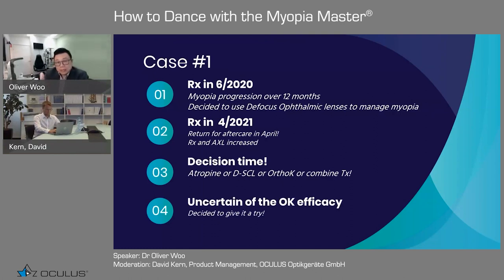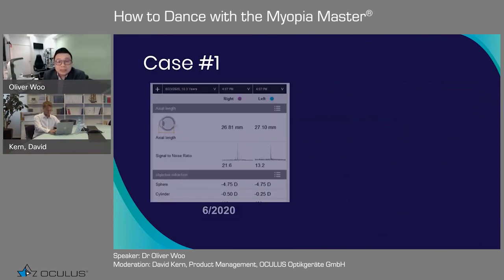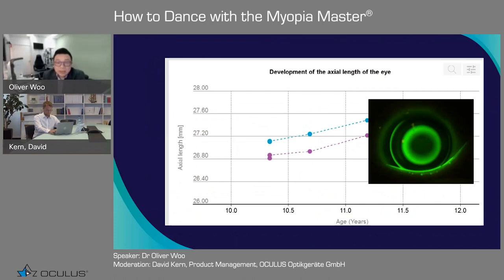So this is the number we can see: the prescription changed about 0.75 over about 8 to 9 months, and axial length changed roughly 0.4 millimeters for both eyes. The parent can understand all these numbers now, because when we show them what it looks like and what it means, they understood it. And the K reading is around 41 in both eyes. So that's the axial length change before we used orthokeratology lenses for managing myopia.